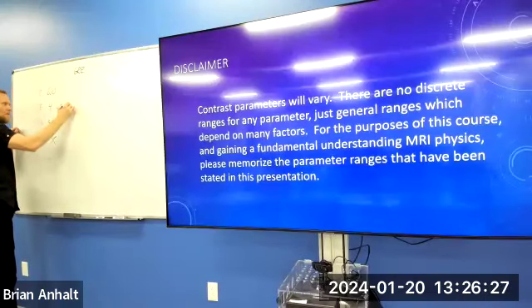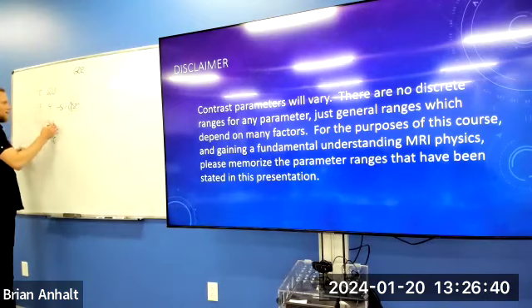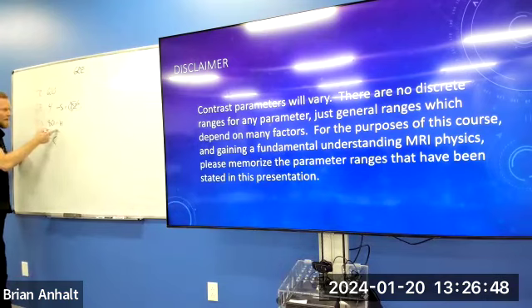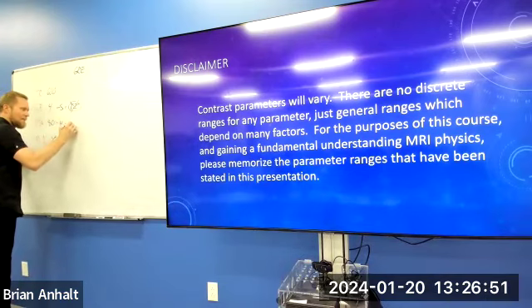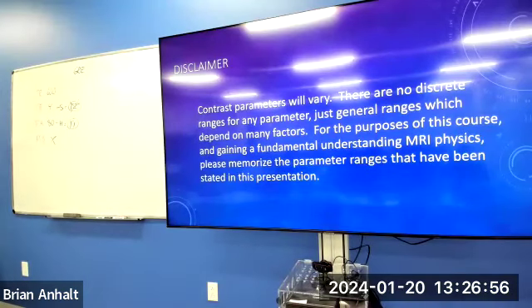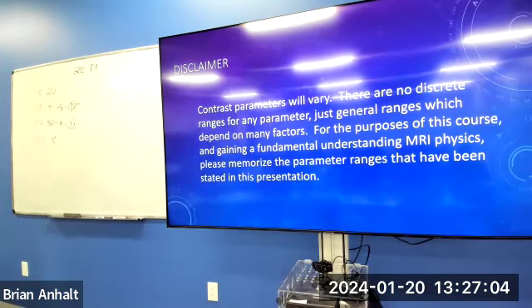What is that doing for us? What does the TE control? What has it done to T2 star? Bam. We don't have T2 star now, right? So we know that it has to be either T1 or proton density weighted. What has this flip angle done for us? Is it high or low? It is high. With the short TR, which we're always going to have, what does this high flip angle do for us? It doesn't allow for full longitudinal recovery in tissues with long T1 times, thus giving us T1 information. So what do we have? T1 gradient echo.